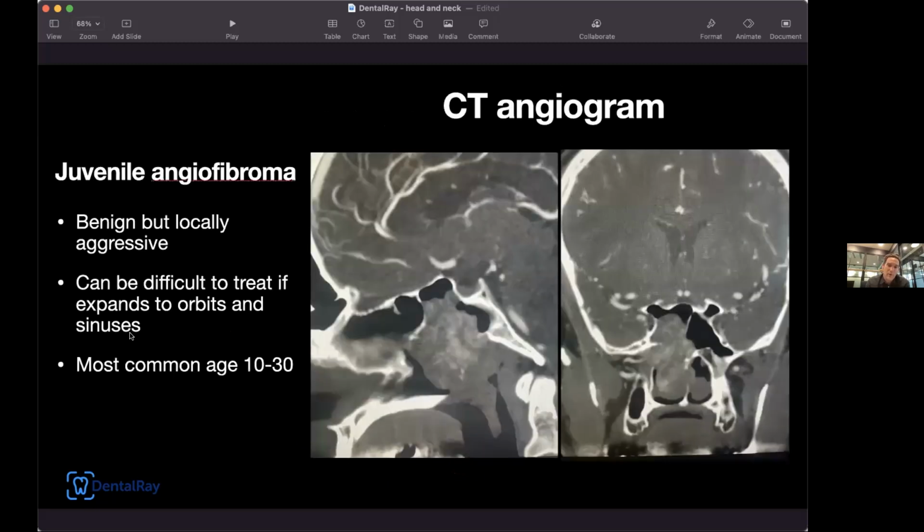And now I'll show you, moving again kind of seamlessly between radiology modalities, a CT angiogram. So it's the same type of CT scan where an X-ray source and detector is spun around the patient's head, but this time you're going to inject contrast at a faster rate so that the high density white contrast is caught in the arteries. And all this white stuff is called enhancement, a highly vascular mass that's in the nasopharynx and it's eroding into the patient's sphenoid bone.